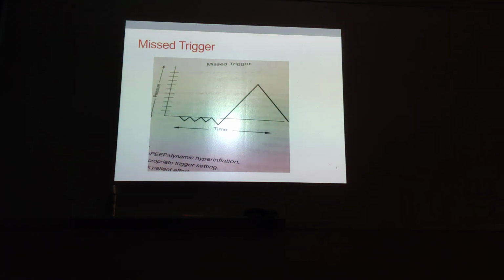Maybe on the HME, you have a bunch of water in there. The ventilator cannot sense the patient's inspiration as much. So the patient is trying to get a breath, triggering, but the ventilator is not responding. So that would be missed inspiration, or missed trigger.